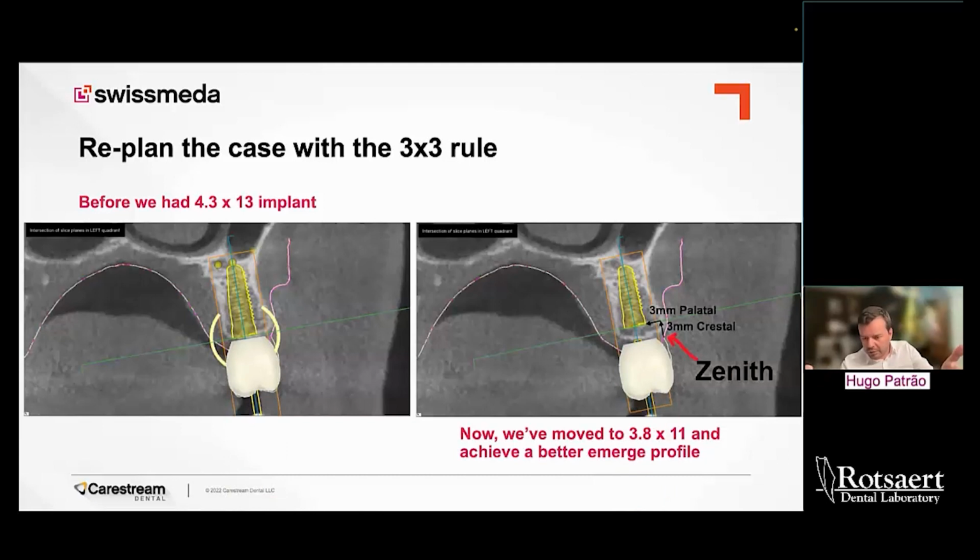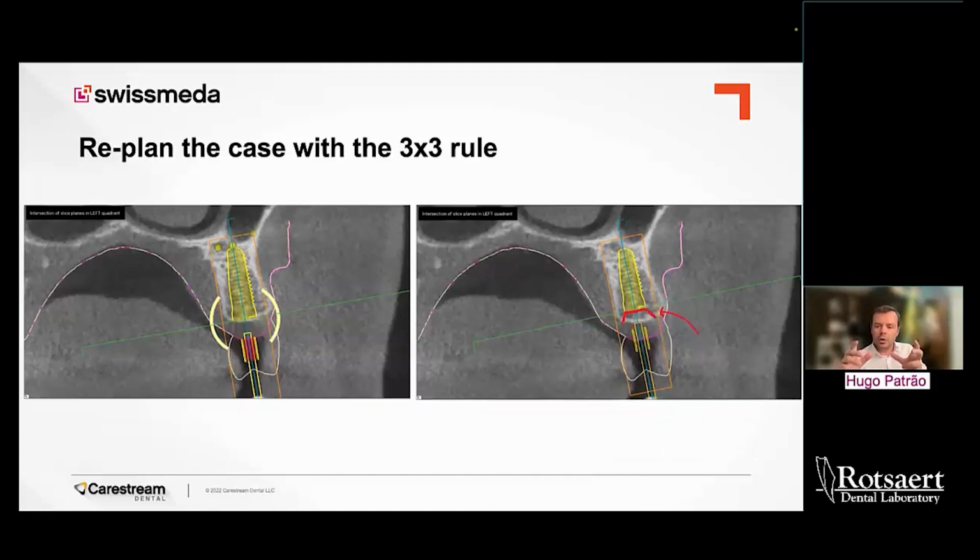Now you're probably looking at that and thinking it's too much bone there. Yes, you need to do some bone contouring over there. But again, this is exactly the beauty of guided surgery. You know that you need to do this bone contouring, but you know it beforehand, so you can even talk with the patient. You can prepare, instead of ending up with a surprise and needing to go fast and try to compensate for all these kinds of surprises during the surgery. That is impossible to plan if you just plan it on a PA, or if you don't know where your crowns are going to enter.